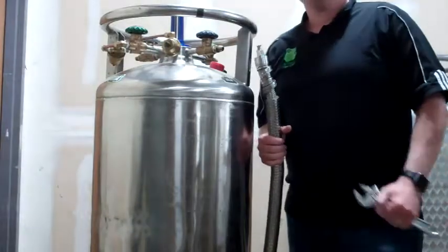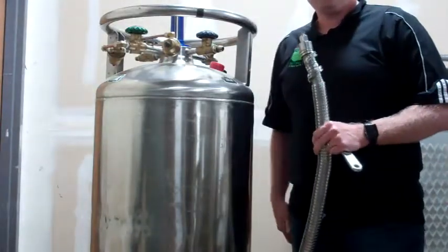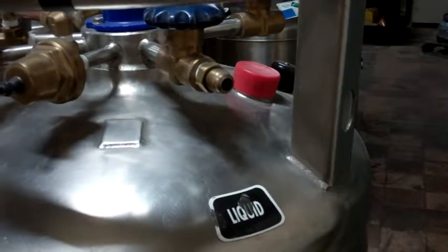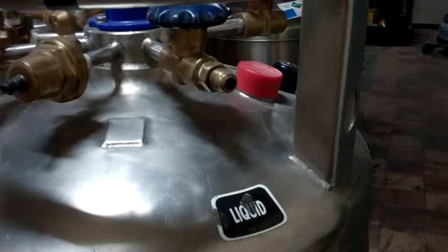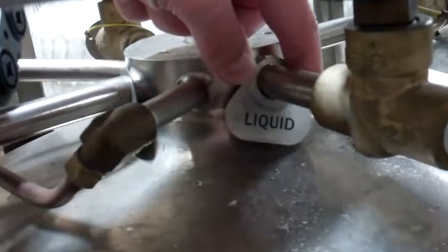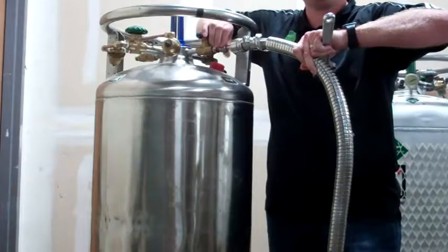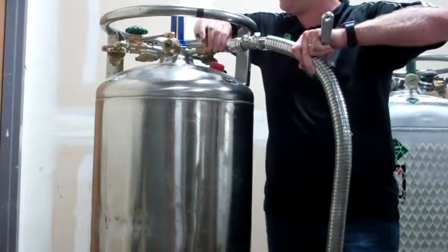Today I'd like to teach you the proper way to couple and uncouple a hose. First, find the liquid valve, take the stainless steel hose, and with your fingertips connect the hose to the brass fitting.